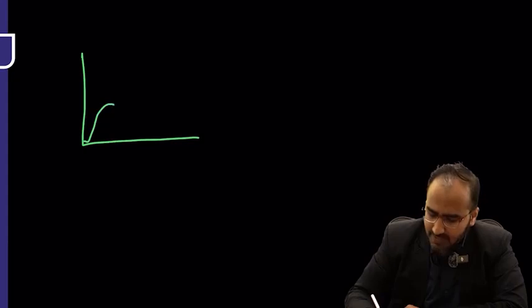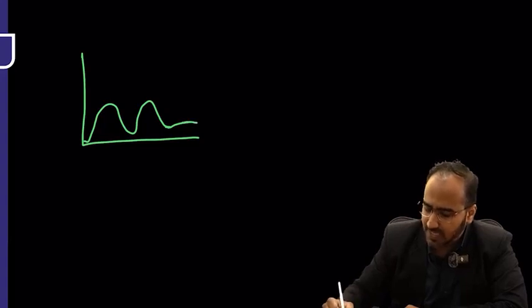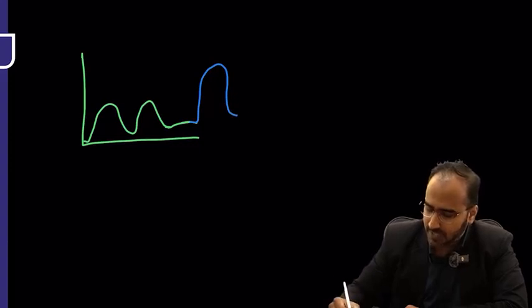The patient is having good breathing. The patient is having one more good breathing. Okay? These are the two breaths given by the patient. Now the patient has still not recovered fully. Now he's become weak in the next breath. Right? In the next breath, the ventilator picks up, and what will it do? It takes the responsibility and delivers the breath. Okay, then again the patient is breathing.